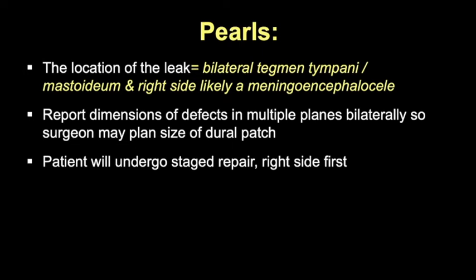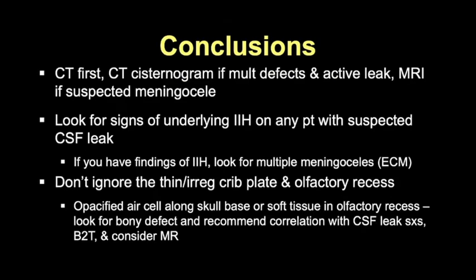So the patient underwent a staged repair addressing the right side first. And one of the other pearls is it's really important to report dimensions of the defects in multiple planes bilaterally so the surgeon can plan the size of the dural repair.